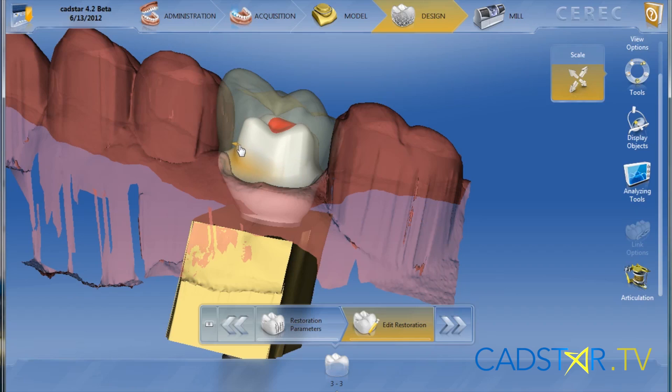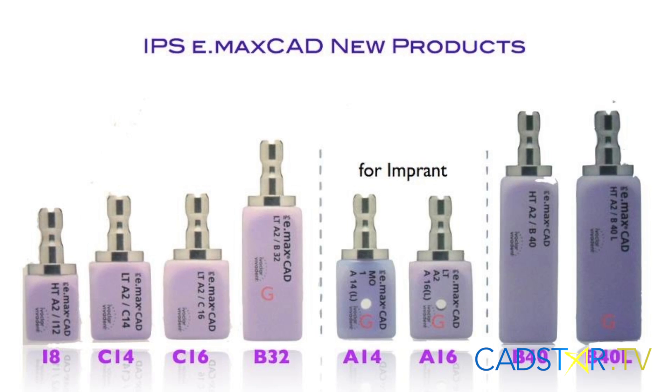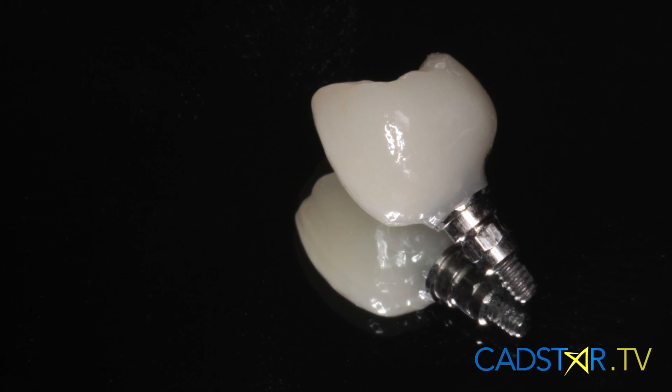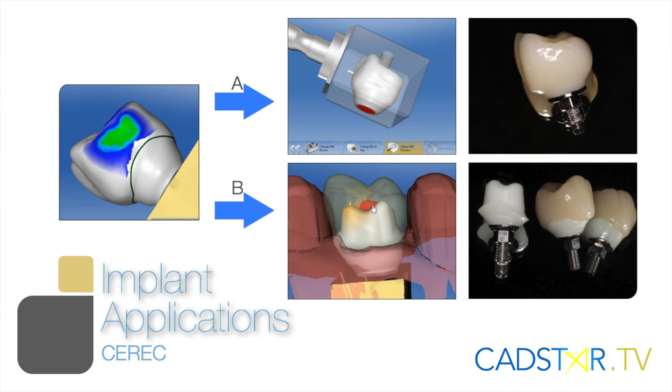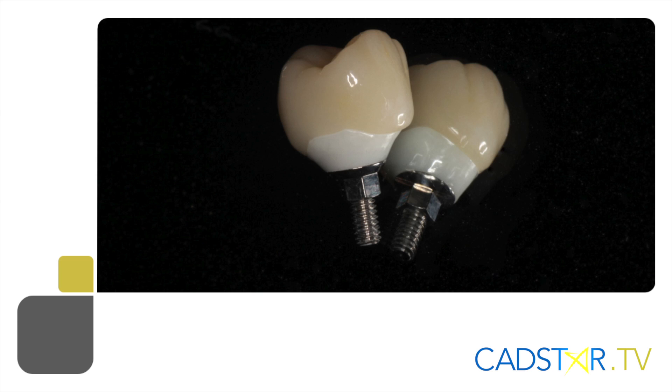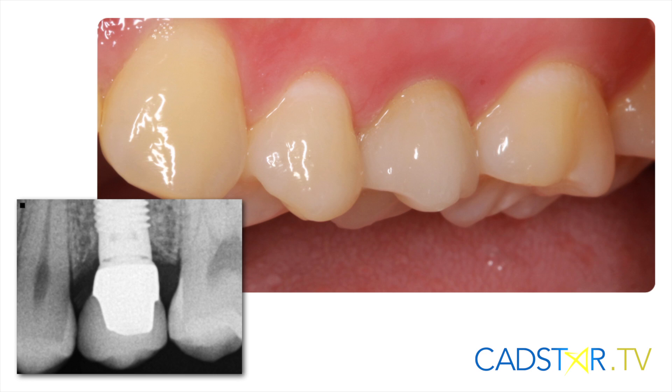Implants chair side — yes, it's in the software, particularly now with the Emacs abutment block, or you can do a solid abutment crown. And we have Encorus, which is our zirconium product from Sirona. They place it chair side.